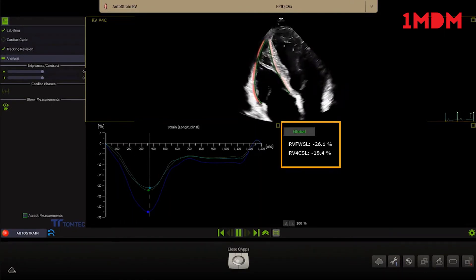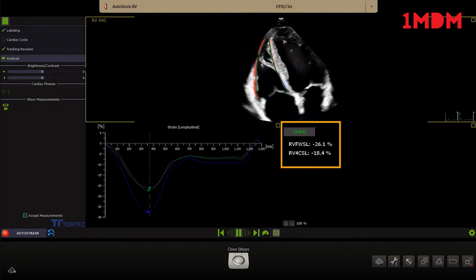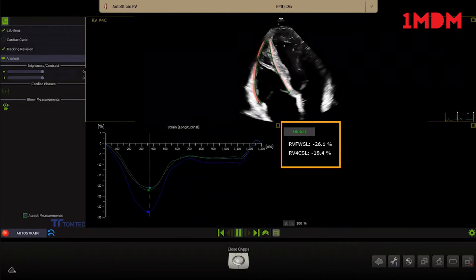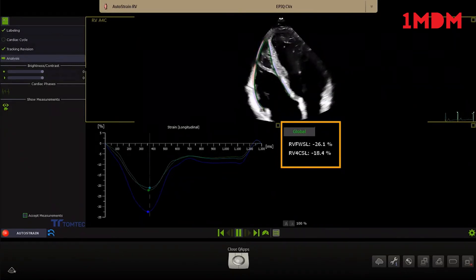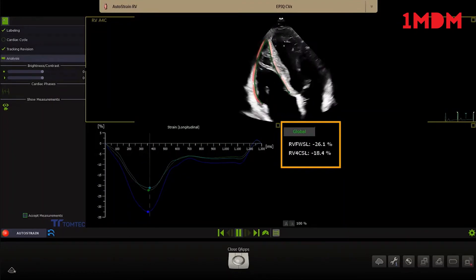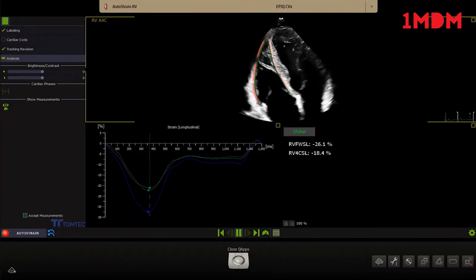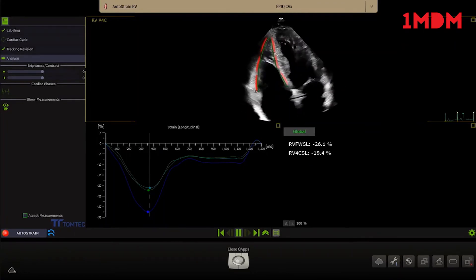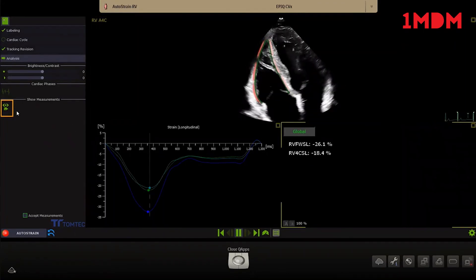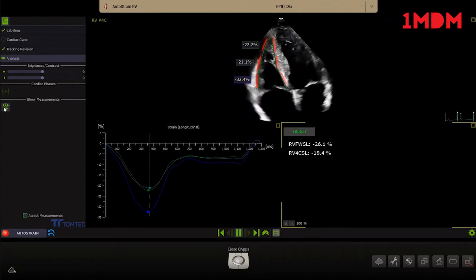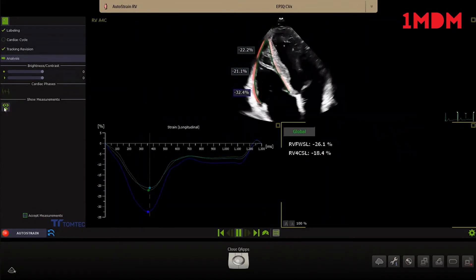The curve below shows the longitudinal strain over time of the three segments of the right ventricle free wall. On the right side, the longitudinal strain value for the right ventricle free wall, and a global longitudinal strain value of the right ventricle based on an RV-focused 4 chamber view is displayed. Click on the icon Show measurements in the left panel to display the longitudinal strain of the apical, mid and basal free wall.